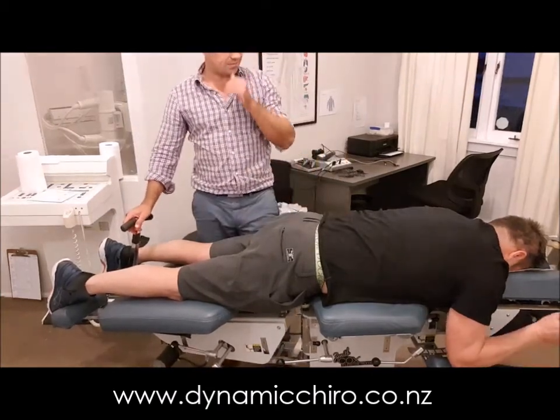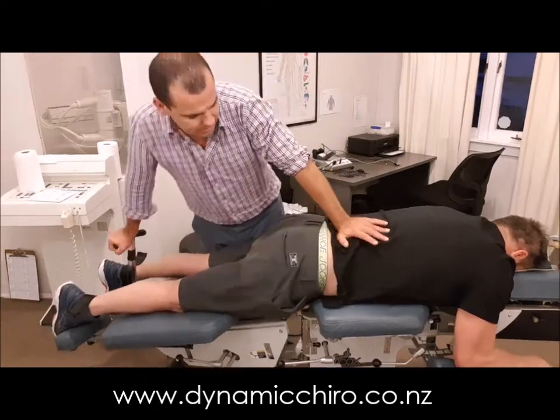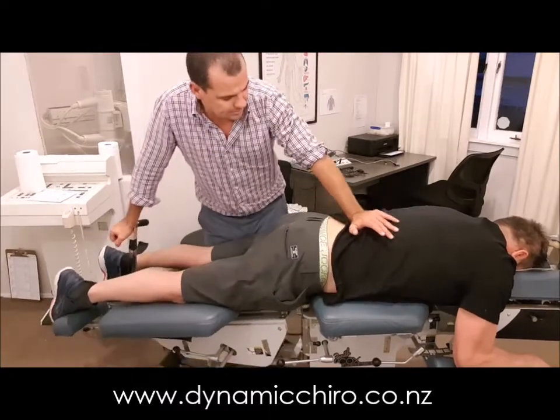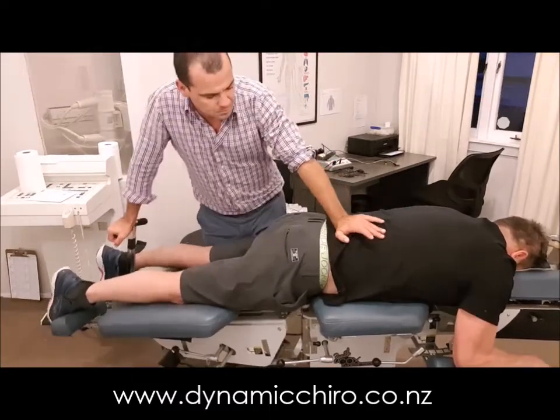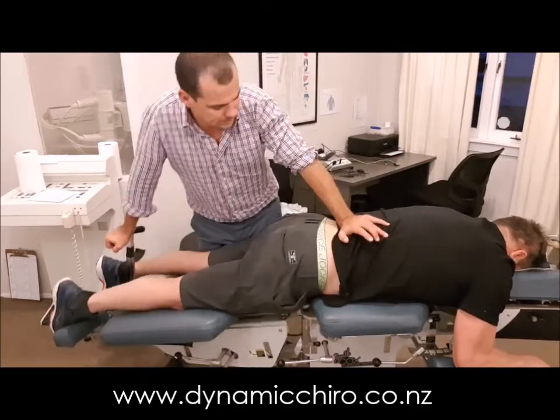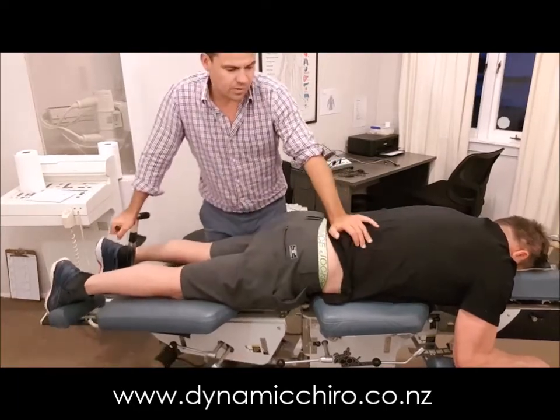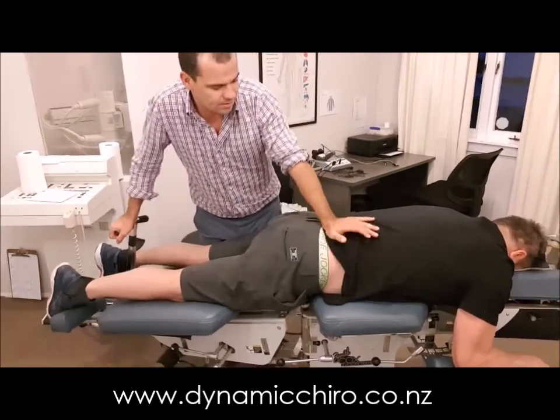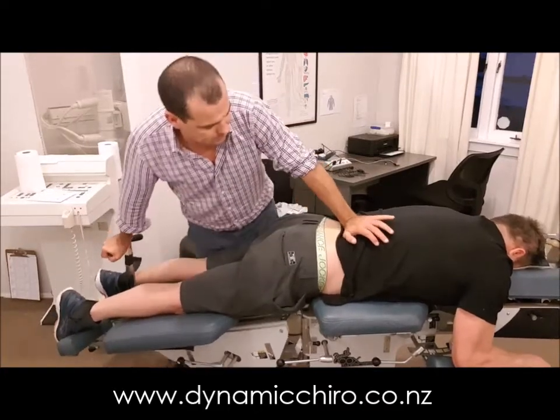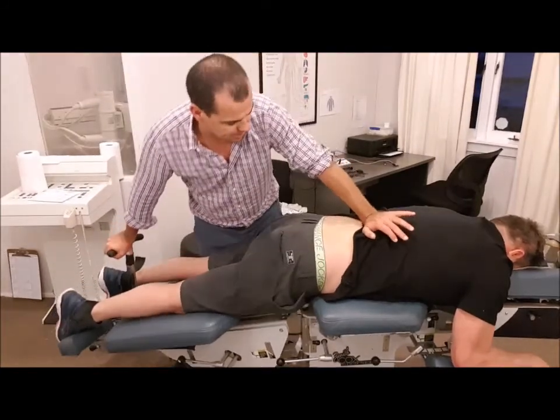Now what we've done here, we've just cocked the table off to the left hand side, and what this does is it opens up the joints well into that lumbar spine, particularly on the right. So again, we work up these joints, and if there's a bulge in the disc that's off to the right hand side — what we call a paracentral disc bulge — what this does is it takes that bulge away from the nerve root. The symptoms that were present only moments before can sometimes dissipate immediately when you're in this position, which is why somebody who's had a disc injury can really benefit from this.